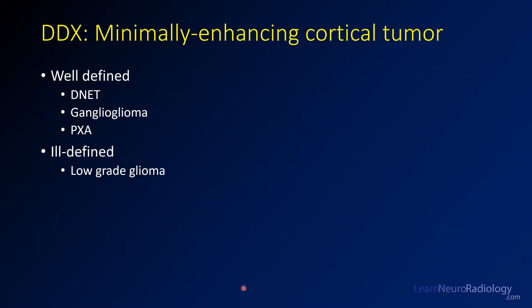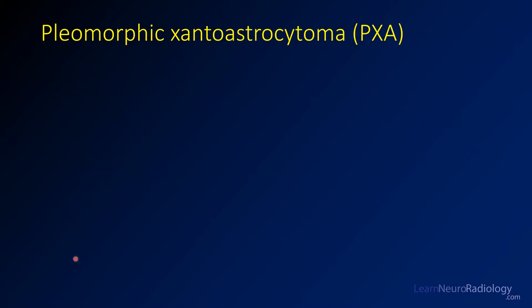The differential for a minimally enhancing cortical tumor includes DNET, ganglioglioma, and PXA. PXAs more commonly have more enhancement, so you'd probably favor the top two. Low-grade glioma is certainly always in the differential, but you'd favor DNET or ganglioglioma. This one turned out to be a polymorphic xanthoastrocytoma. As I said, you're not always going to be able to tell the difference between these tumors.